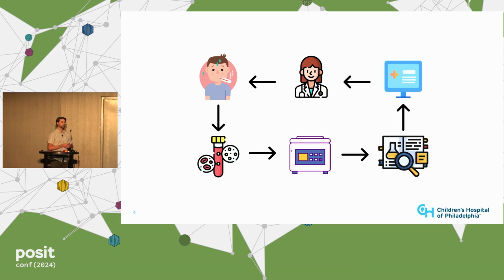But sometimes the wrong decision is made or the wrong treatment plan is implemented. And it's because there's wrong results in the chart. And those wrong results are not because the machine makes a mistake, and it's not a human error mistake by somebody reviewing the results, but rather the wrong blood was put into the tube in the first place before it ever even got to the lab.